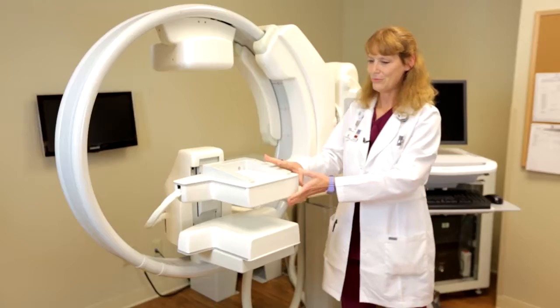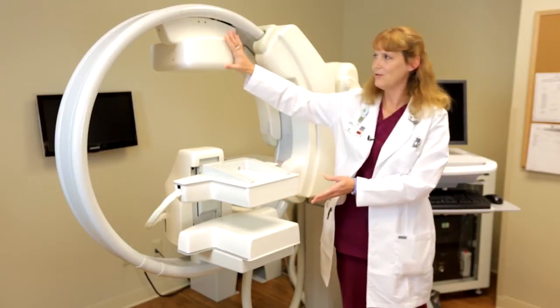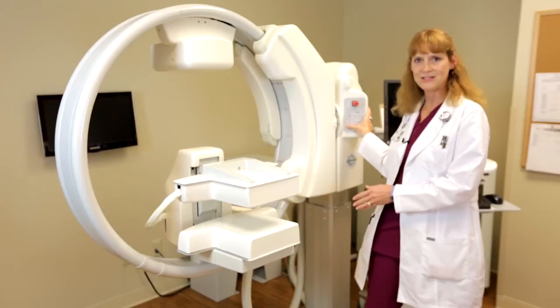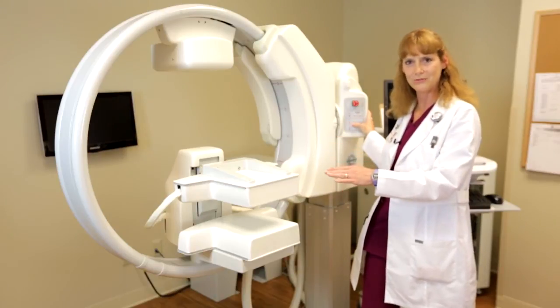This is a LumaGym molecular breast imaging system, or MBI. We have dual head digital detectors, a ring gantry with the counterbalance, and manual controls that allow us to bring the system up and down and also move from CC to MLO or lateral views.